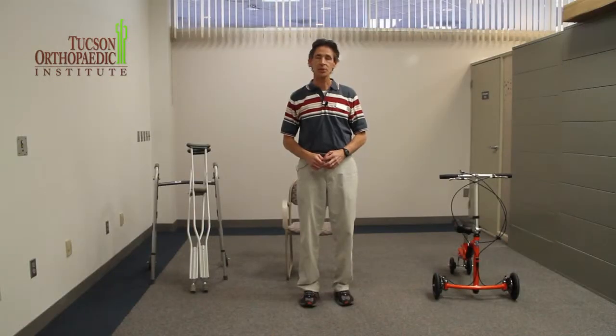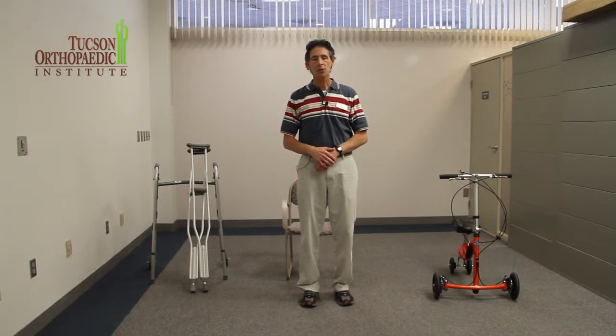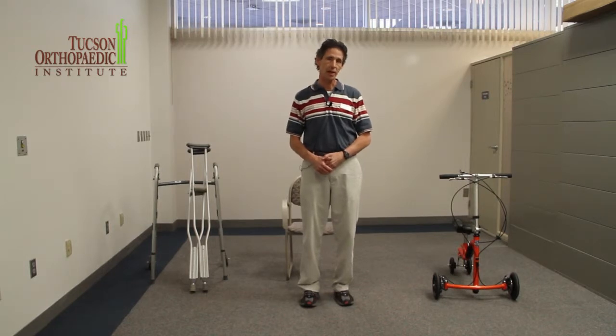Hi, my name is Duane Schneider. I'm a physical therapist at Tucson Orthopedic, and I'd like to show you today how to use assisted devices. Assisted devices could be crutches or a walker to help you get around when the doctor does not want you to put any weight on your lower extremity, like your right leg or your left leg.